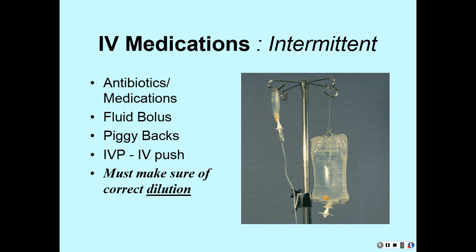Okay. And again, you have to look at the med, and is it something I can piggyback in with my solution that I've got going? If not, you may need to have another IV access. Okay. You may have to stick your patient again. And that's not a doctor's order. That's you knowing that you've got to have another IV site. Okay. Got to monitor the patient's response. Y'all know that.